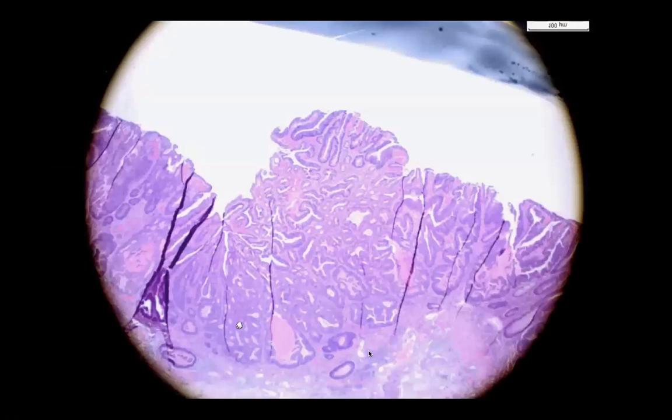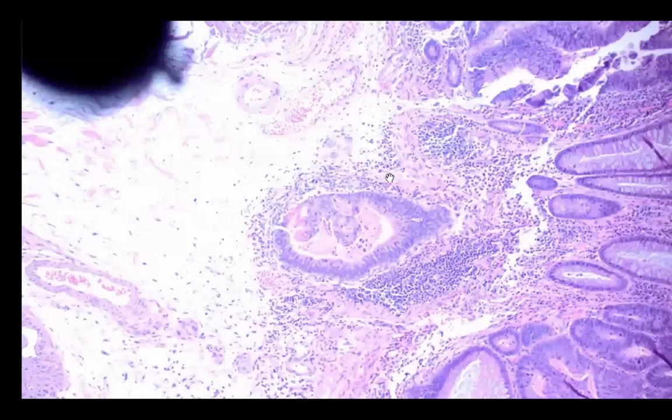So this is the pathology. All right, Elvie, you want to talk about that? Okay, Raju. The pathology shows adenocarcinoma, so you see these glands that are fused together and crowded. Do you have another picture, Raju, or is this the only one? This is the only one. So can you show the muscularis mucosa layer? There it is, the pink layer. You can see that these glands have actually pushed through the muscularis mucosa and are below that.